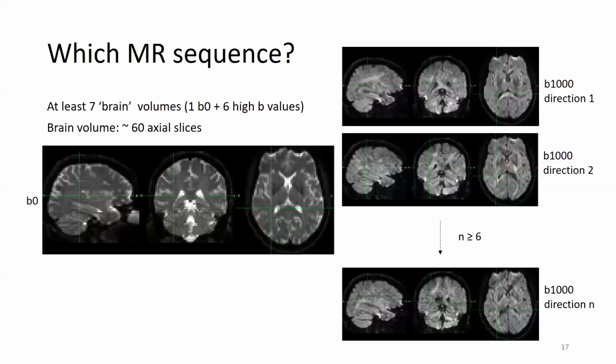So how do these images look? Well, here I have the B0, at 3 different orientations. I make the images typically transverse, so axial in this direction, from top to bottom or from the bottom to the top, and that's shown here on the right image. But with my software, I can immediately see how they look in the 3 other directions, so in the sagittal orientation or in the coronal orientation, and where the cursor is in the green lines, you see all the different directions.